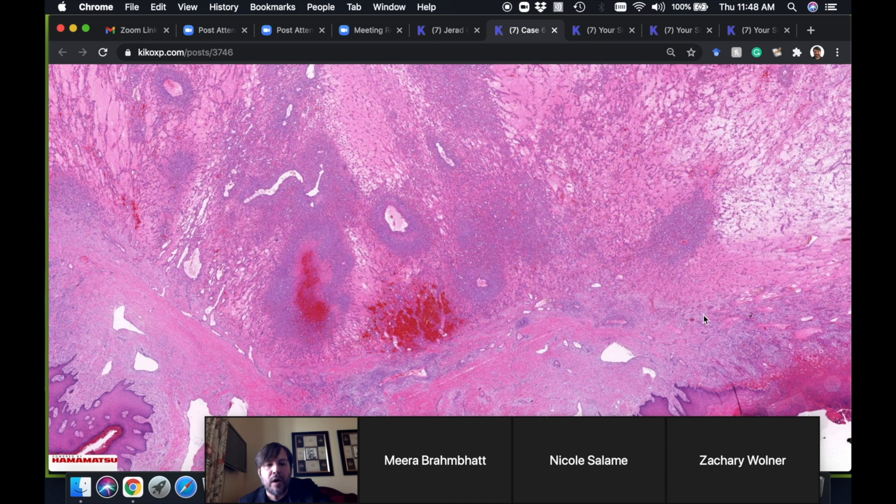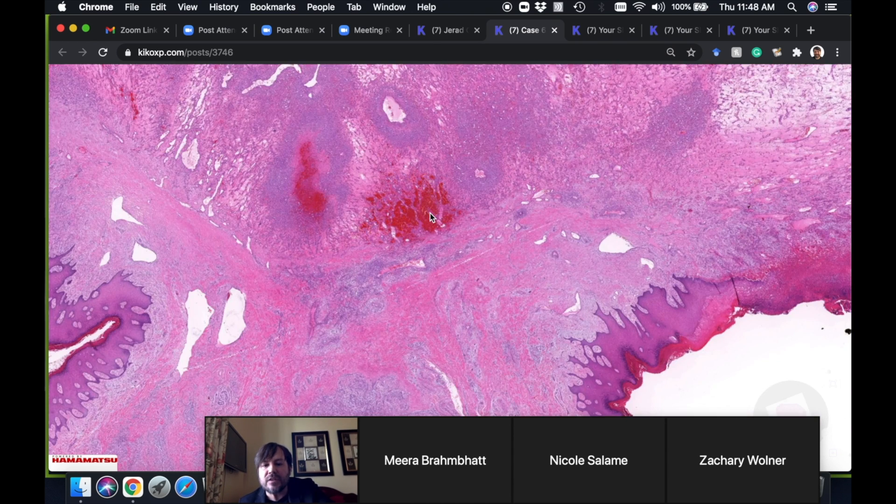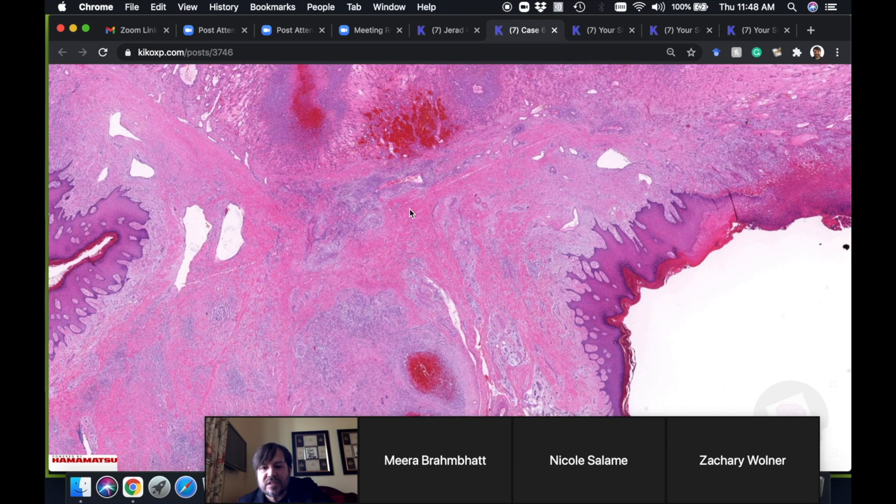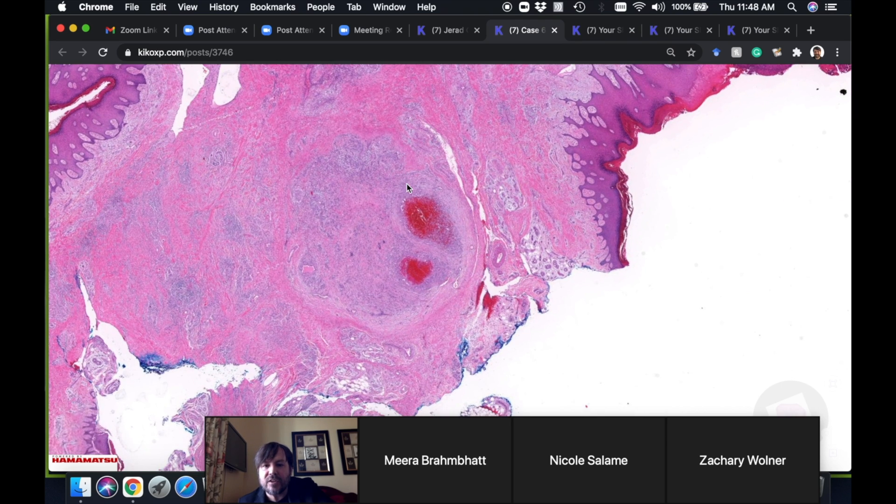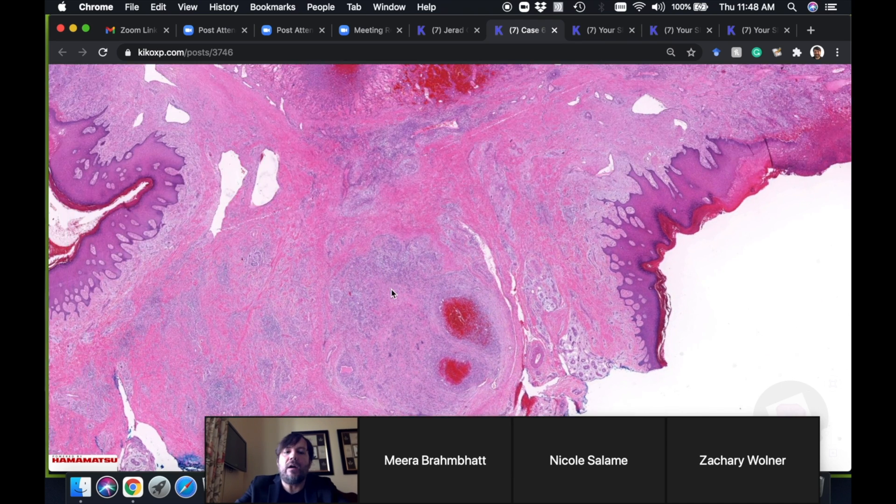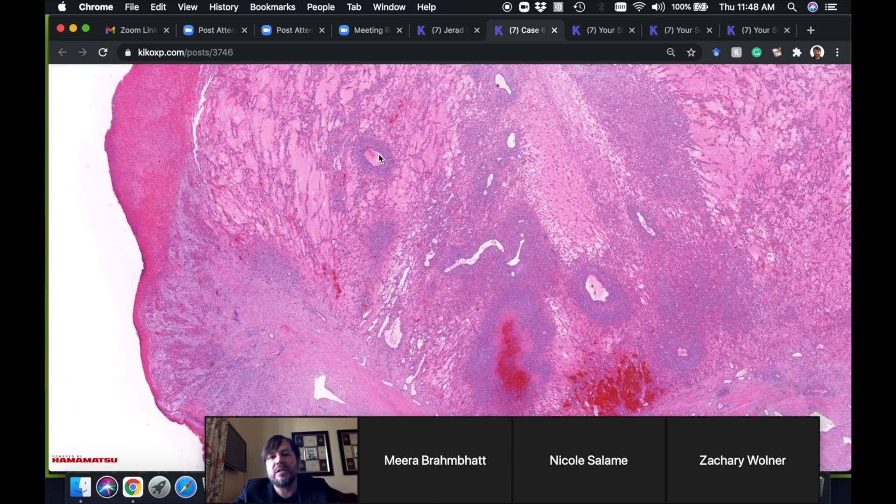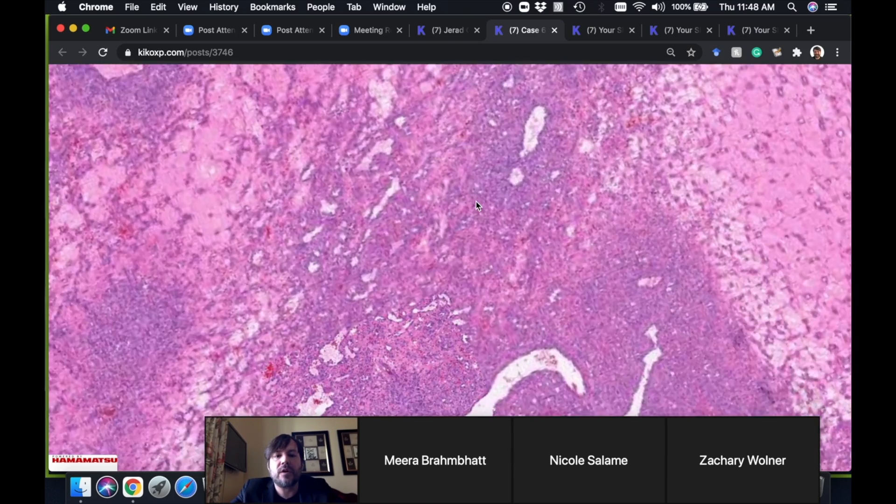In the middle of a PG it can look pretty busy, but when you see the whole thing out or the edges, it tends to look much more organized. You can see like a nice edge of the lesion here, and there's a little bit more extension down here, but even down here look—it's a lobule. That can be helpful.